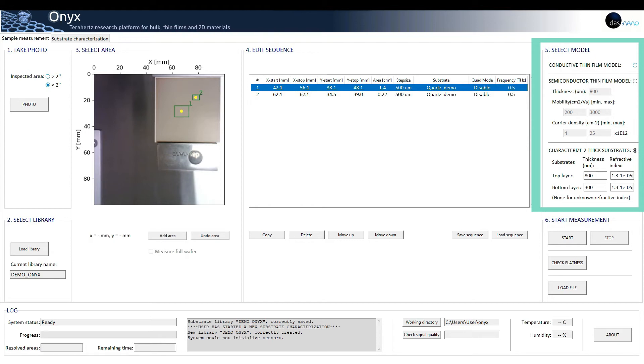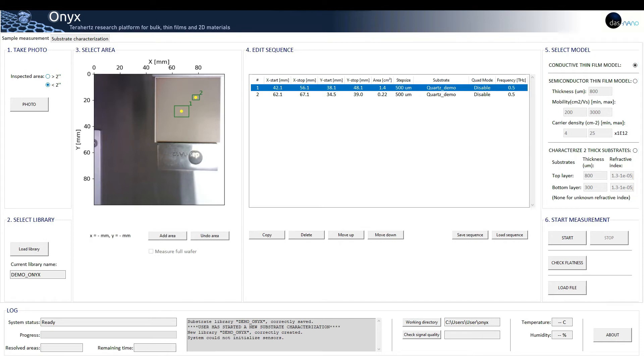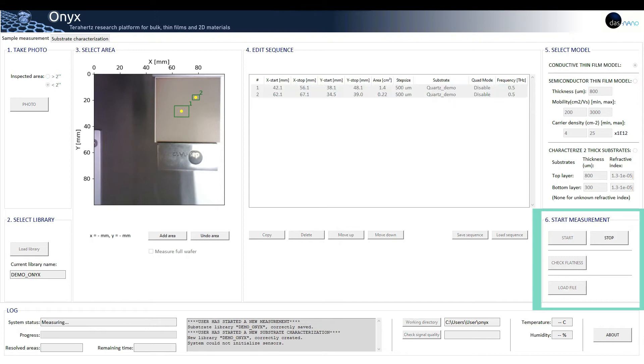Except for the first model, the user is recommended to complete a series of approximate or expected information from their samples to reduce the measurement processing time. For this demo, we will select the conductive thin-film model, which is appropriate for the samples we want to inspect.